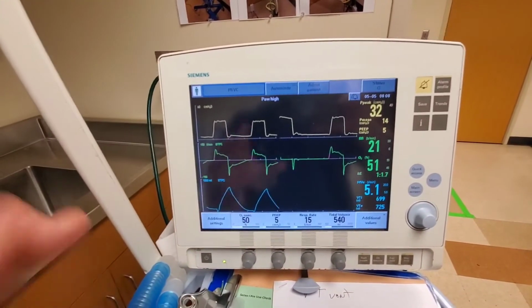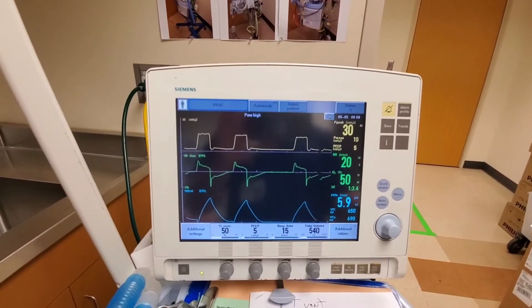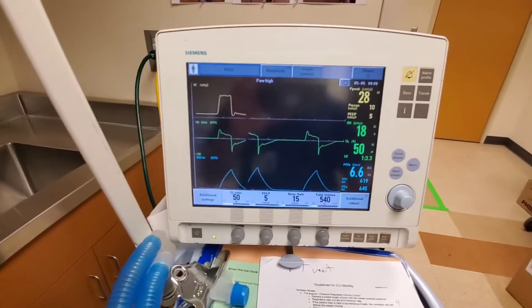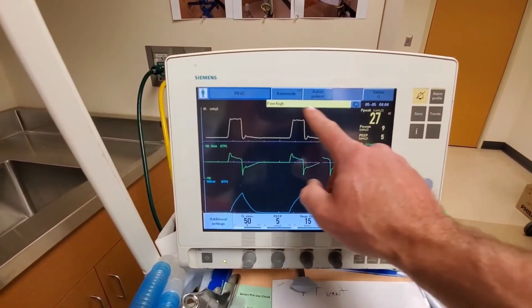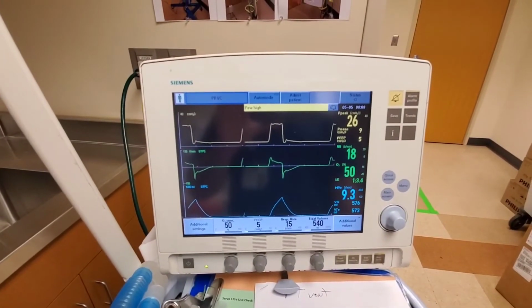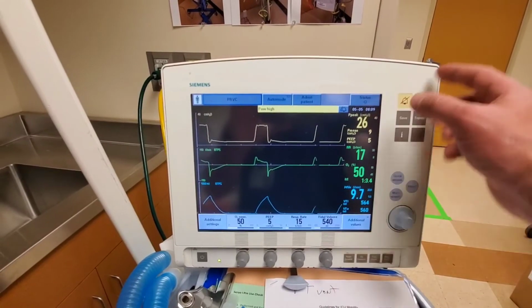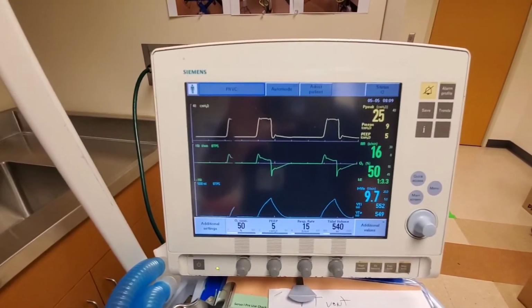When you hear an audible alarm, that means something is bad, like you heard the audible alarm. And now everything's returned to normal. I let it go, or perhaps the patient quit coughing. So you no longer hear an audible alarm, but you still have this message here. So everything's okay. That just means something was bad a while ago and nobody's canceled it out. And so we just cancel it out, and then it's gone.